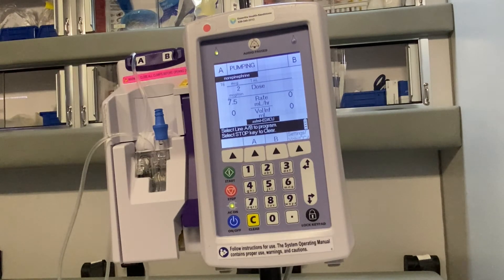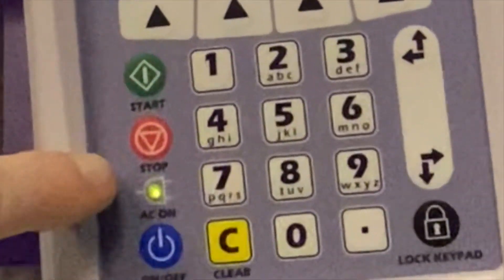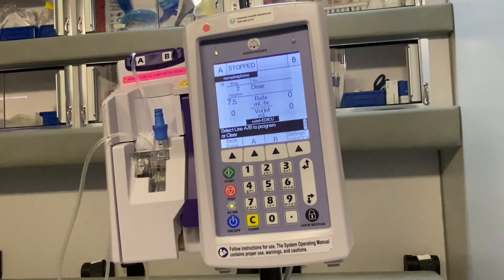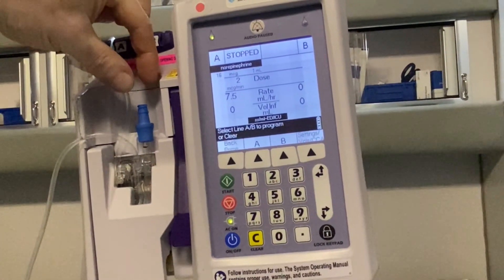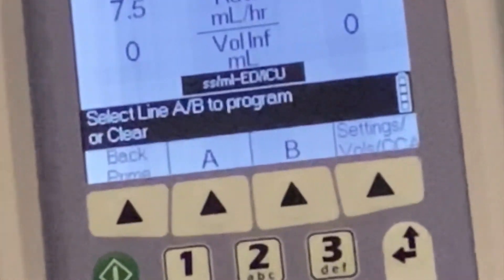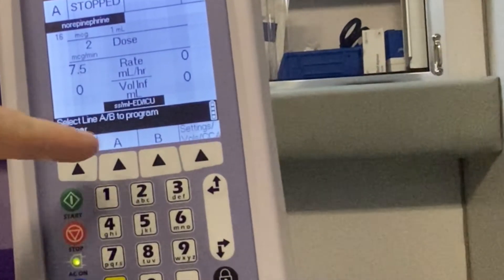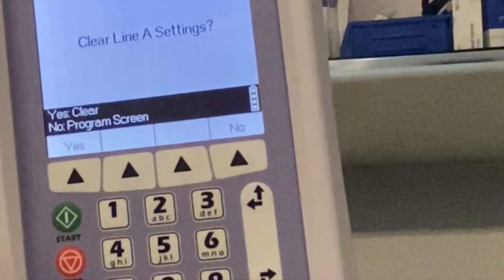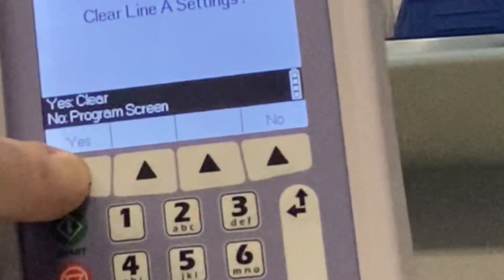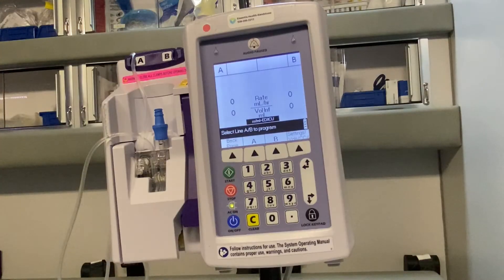To stop, we just hit the stop button. If there are air bubbles or something we want to back prime out of, we'll cleanse the port up here, put in a normal saline syringe, and then hit the back prime button. We can also clear line A if we choose. We can say program, yes, clear — and we can start all over again and adjust our drip or start a different drip.